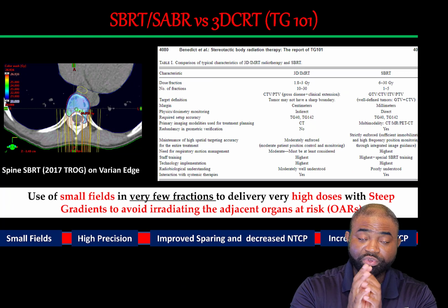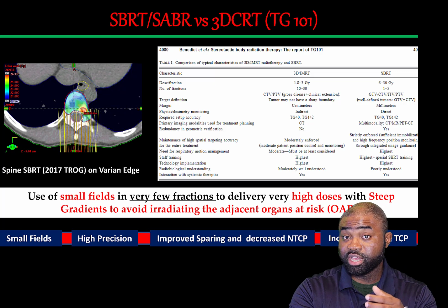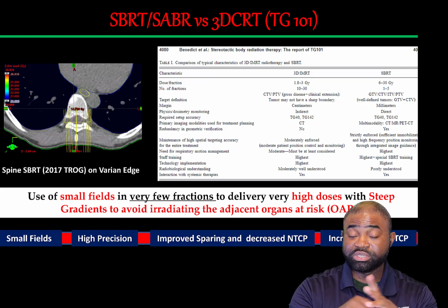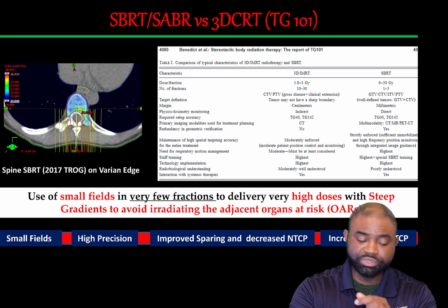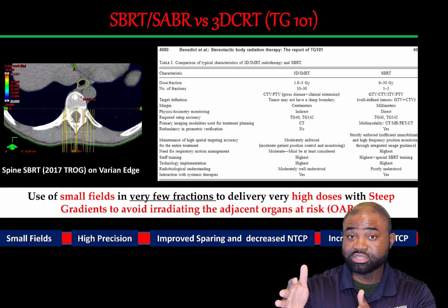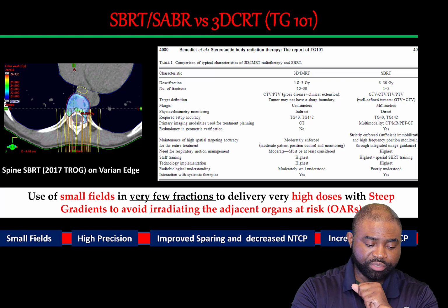When it comes to the required set of accuracies, in both cases, we primarily use TG142 as well as TG40, and for stereotactic procedures, MPPG9A. But for conventional radiation therapy, we use TG40 and TG142. And so the common intersection in this case is TG40, TG142, but specifically for SBRT, SRS, we have MPPG9A, we have TG101, we have TG142, and we have TG40.